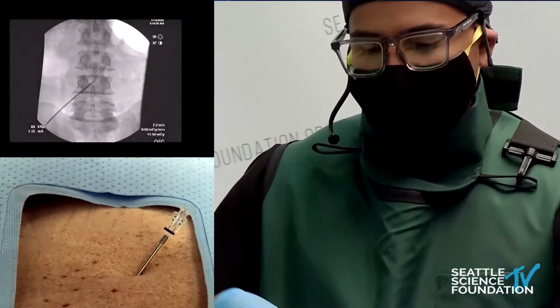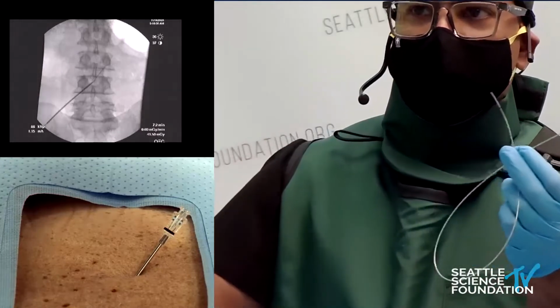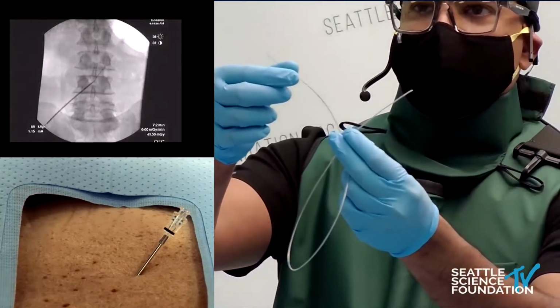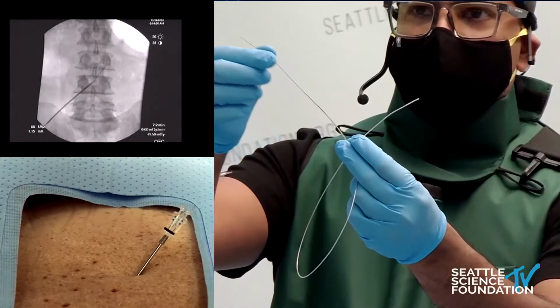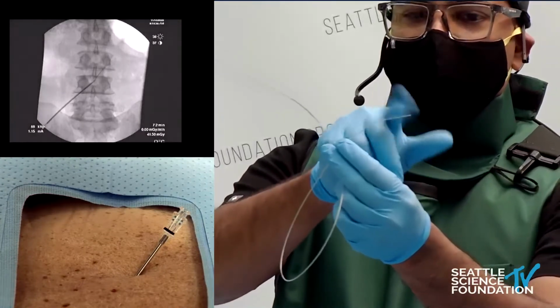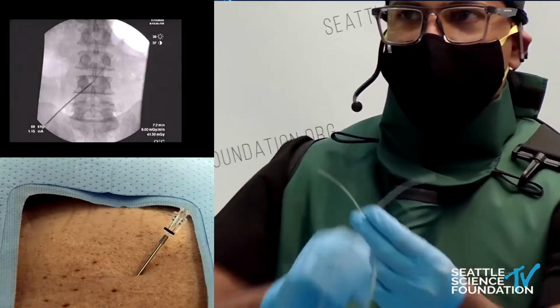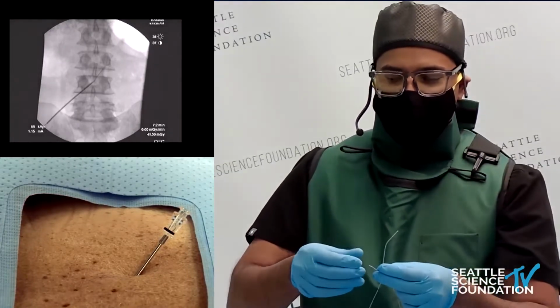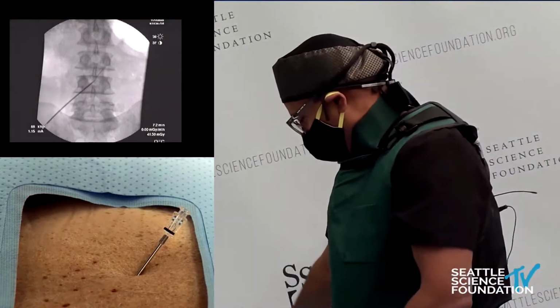And then inside the lead is a stylet, which is really hard to see, but maybe with the white background, you can see it there. This gives the lead a little bit of rigidity, so it's sort of uncooked pasta, and then when I remove this, this becomes cooked pasta. So I like to call this the capellini, or the vermicelli of spinal cord stimulation, and your dorsal column is the spaghetti. Mario's on the call, so I have to give him some Italian props.